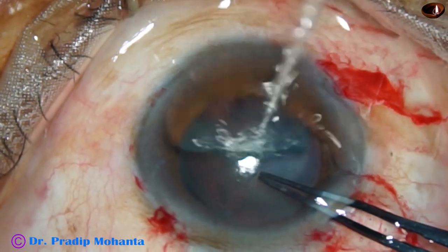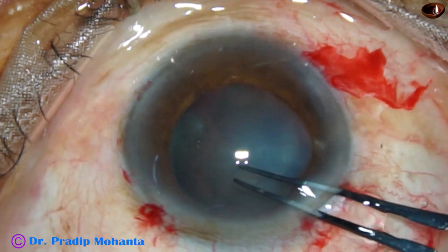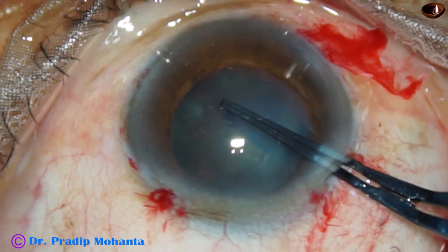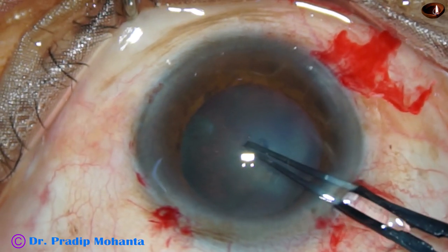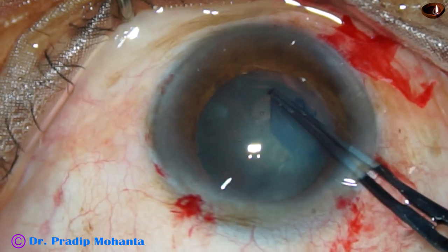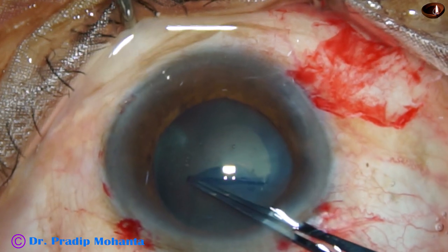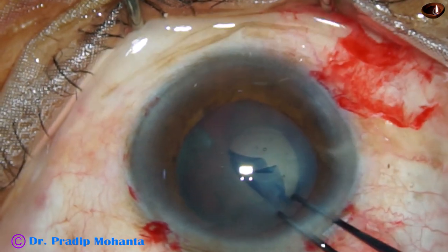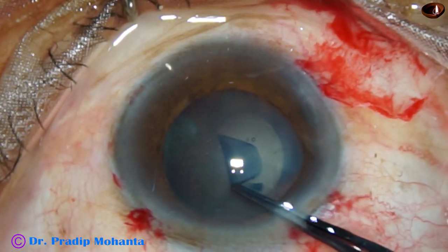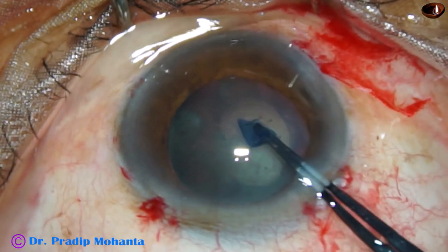I must not make a big rhexis. I must make a rhexis of about 4.5 mm so that I can apply a CTR — capsular tension ring — in the capsular bag. If the rhexis is large, the CTR may tend to come out. So this rhexis is about 4.5 mm and this should be okay for this case.